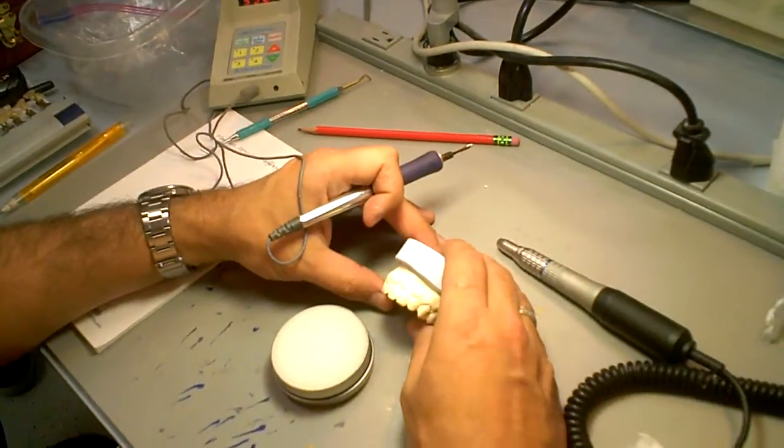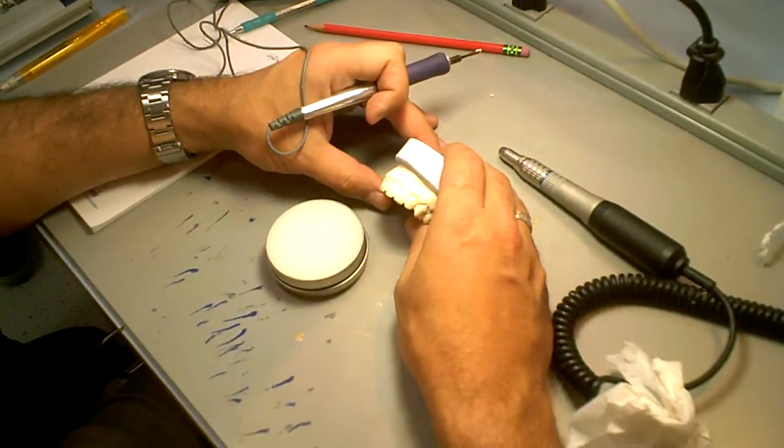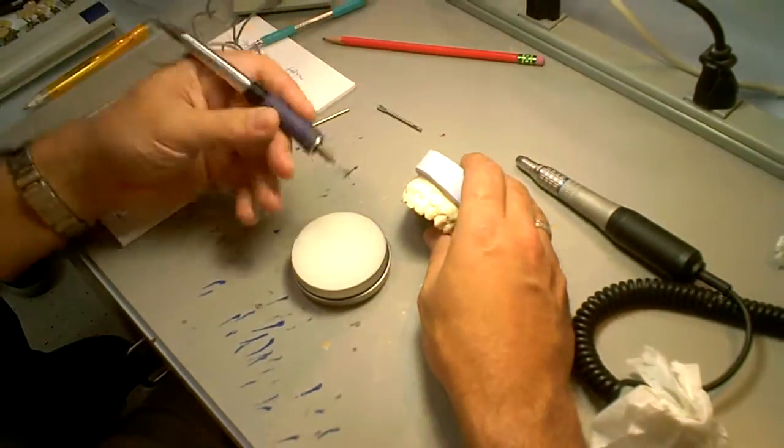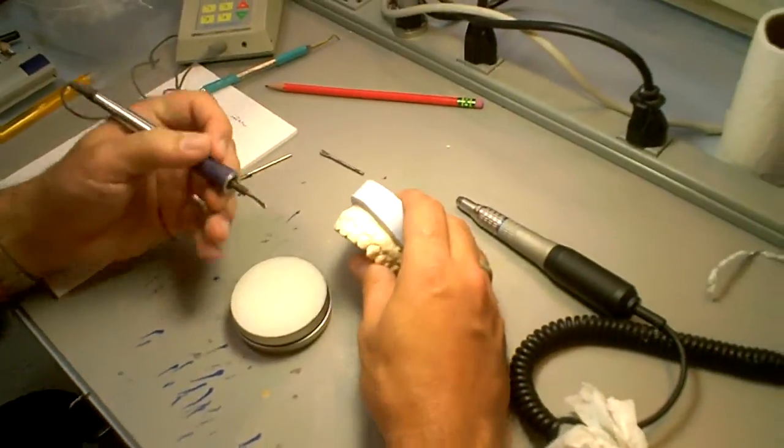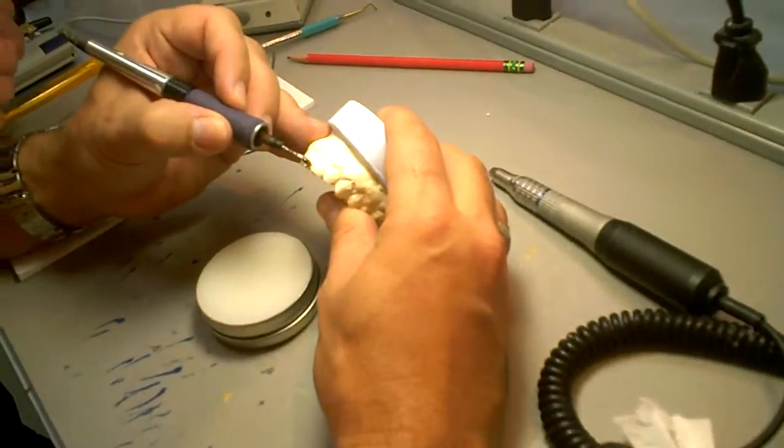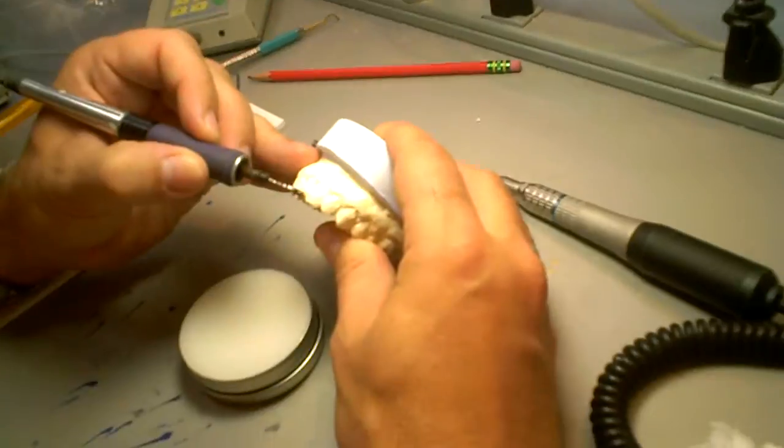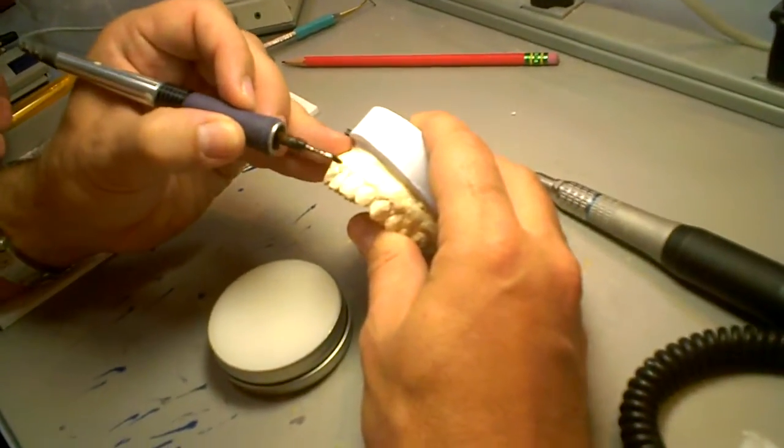And I gave that to my doctors and they're like, what the hell is this? So I started using white wax. You'll see that every movement that my hand makes is going to be in the direction that I want the restoration to end.